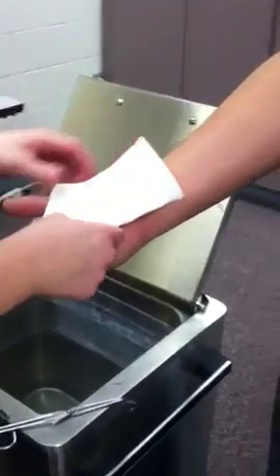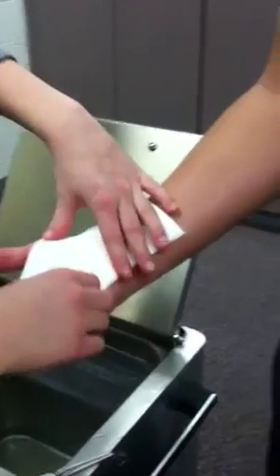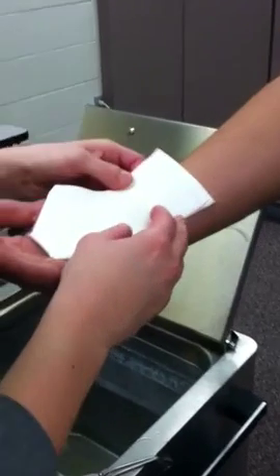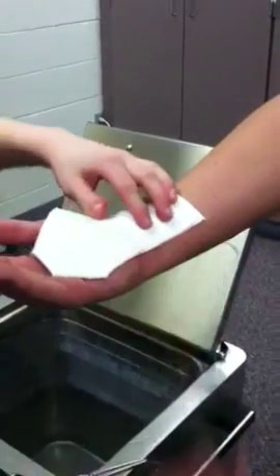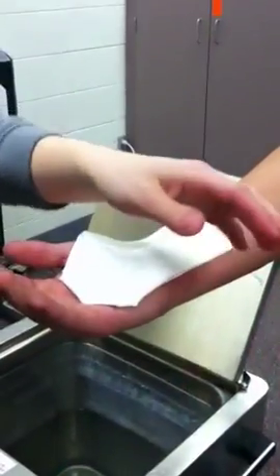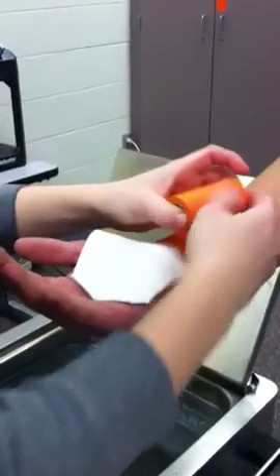So she's going to take it, she's going to reapply it to the wrist, and then what we can do at this time is, if you need to cut more corners, you can re-dip, but for instructional purposes, she's going to take some pre-wrap and hold it onto the wrist or the body part as much as you can.